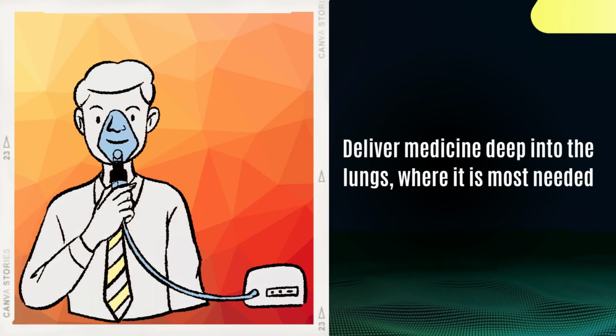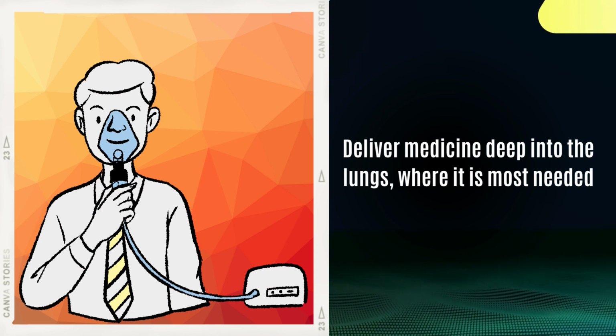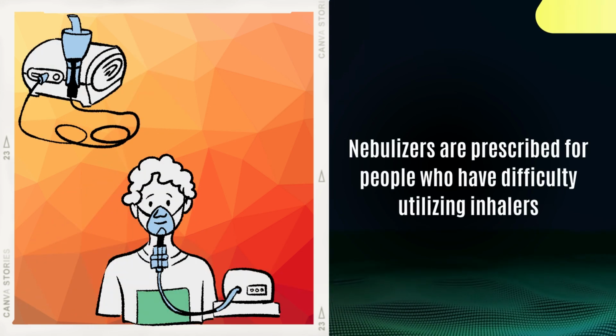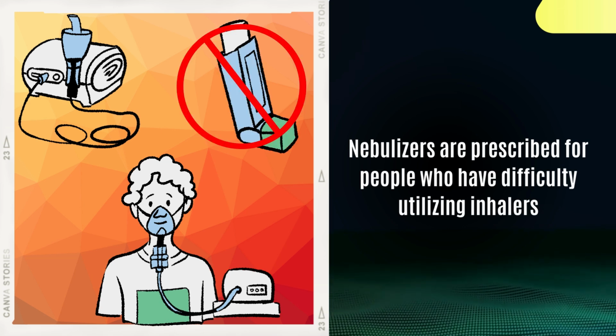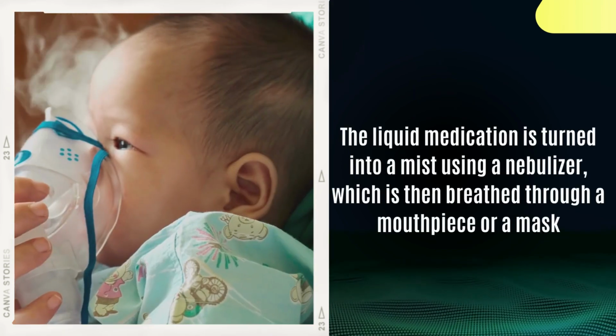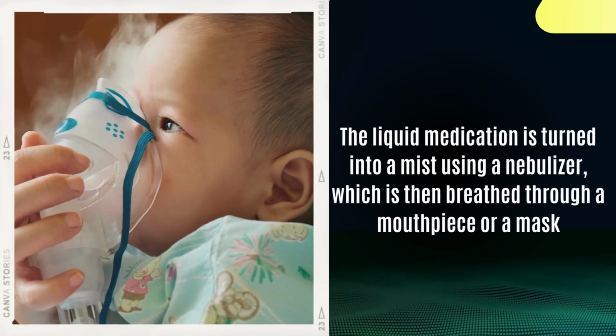A nebulizer is used by patients with COPD and asthma to deliver medicine deep into the lungs, where it is most needed. Nebulizers are prescribed for people who have difficulty utilizing inhalers due to medical conditions or cost reasons. The liquid medication is turned into a mist using a nebulizer, which is then breathed through a mouthpiece or a mask.